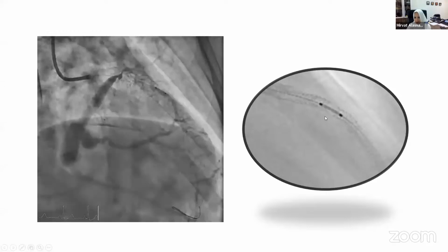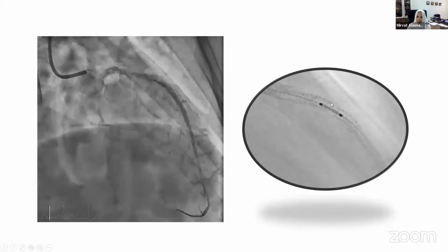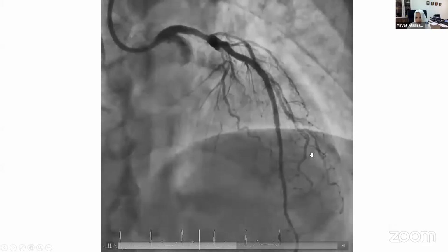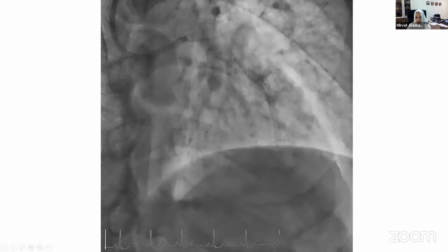We're using stent boost. You can see a very tiny gap between them. Took an 8 millimeter stent to cover that gap and post-dilated, and actually ended up looking fine. And we did a final angiogram, final OCT run as well that showed the overlap segments. So those are things that you can pick up with imaging, but you need to train your eye and you don't need to rush it. And automation can miss some of these issues.